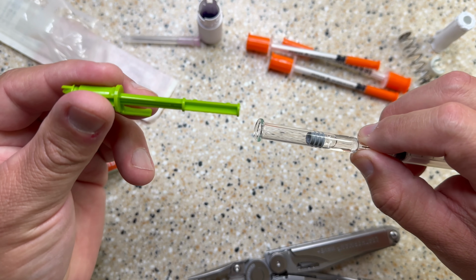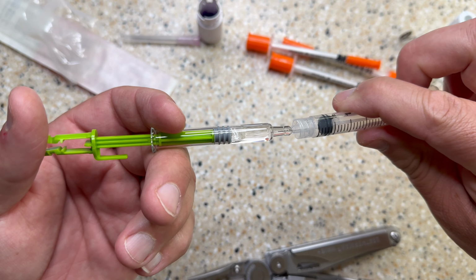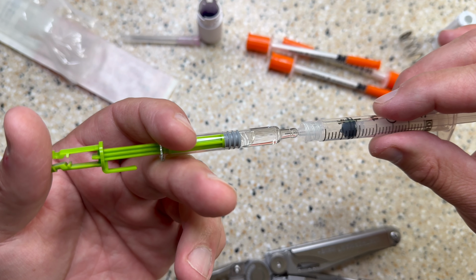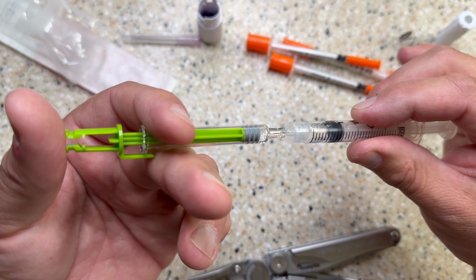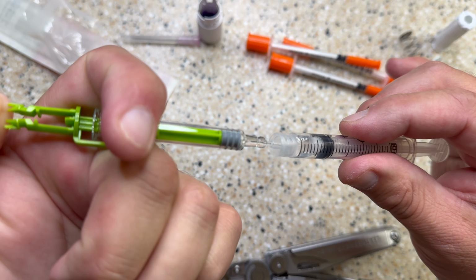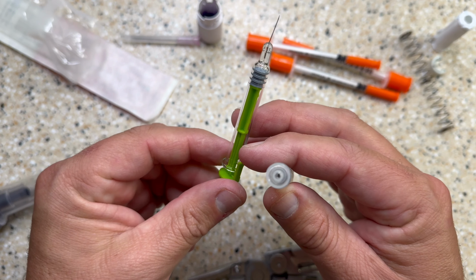And this is where I take this plunger and insert it here. As you can see, I accidentally depressed this back, so I'm going to draw it out with my finger. And now we can go ahead and inject it into this syringe. Give it a few good squeezes here. Just want to make sure everything's out of there. And that's it. This glass portion can be discarded safely at this point.